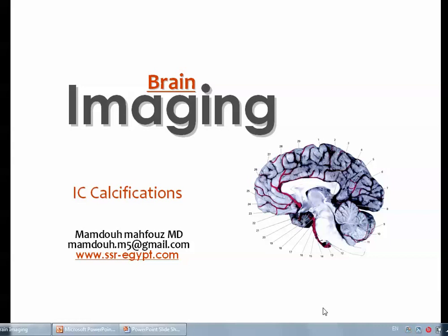Dear colleagues, this is the fourth lecture in the series titled Radiology, Diagnostic Radiology in English, referred to by the letters DRE. In this lecture, we'll handle a small subject which is concerning with the diagnosis of intracranial calcifications.